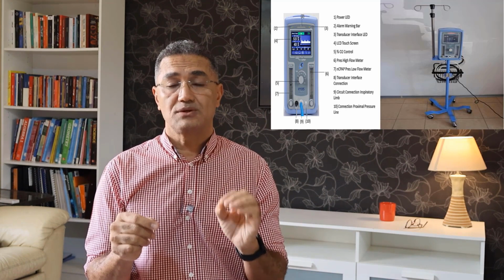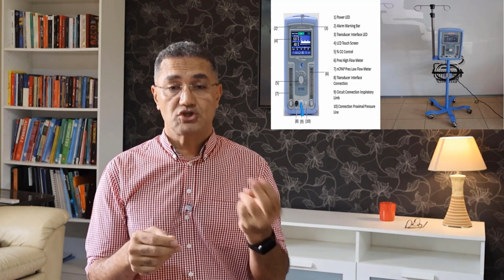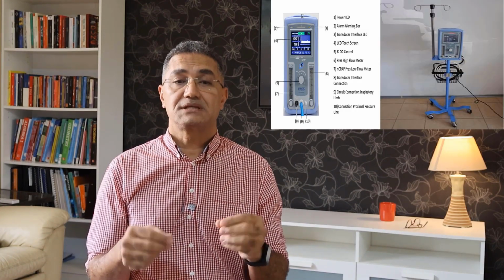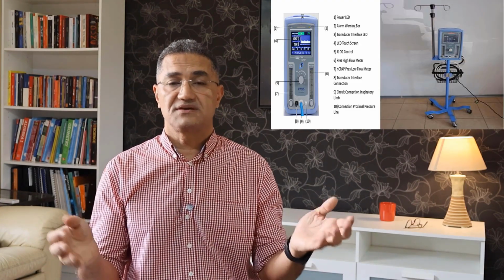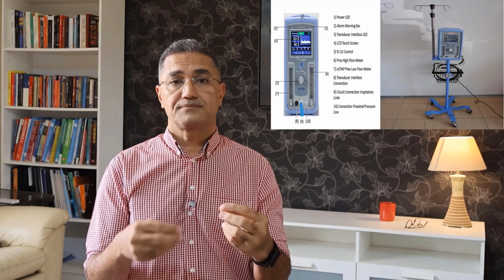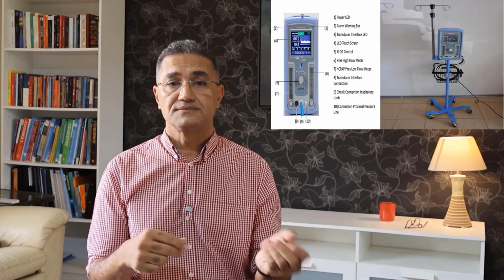And then it has a very important characteristic, which is the PEEP. So if you use it to provide PEEP, it has that feature. The PEEP, however, has a maximum of 10. What does maximum mean? It means that if I want to give the patient CPAP, I can set it to 5, 6, 7, or 8, as you like, and this is usually the regular mechanism that we want. The regular level, usually we use 6, 7, or 8, and some people use 9.